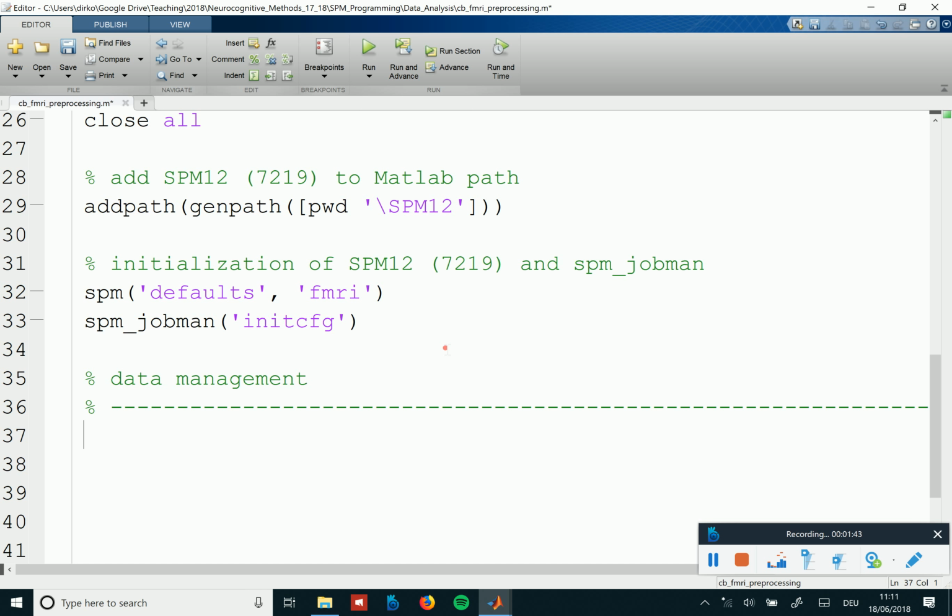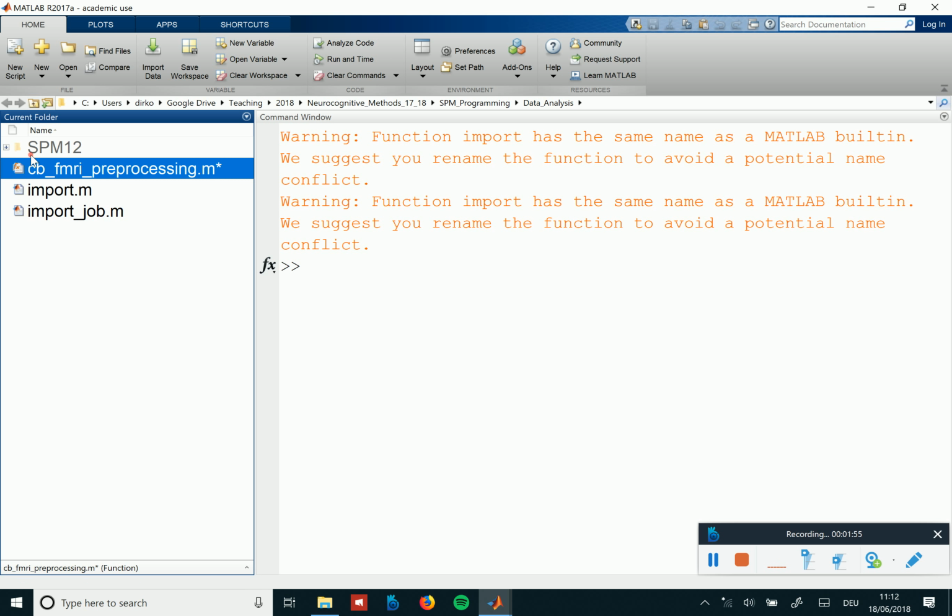And to this end, of course, you need to think a little bit about what you have, and we know that we will have hierarchy files from different participants, either in this non-BIDS structure or also in the BIDS structure. The data sets from individual participants in fMRI are saved in individual folders. That's also now the BIDS standard. Of course, there's no need to do that, but that's often how it's done.